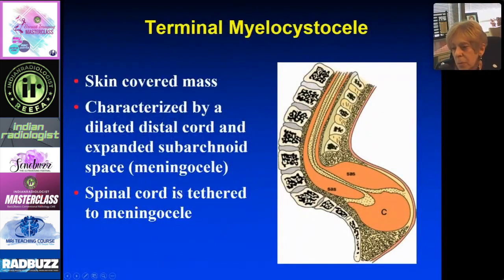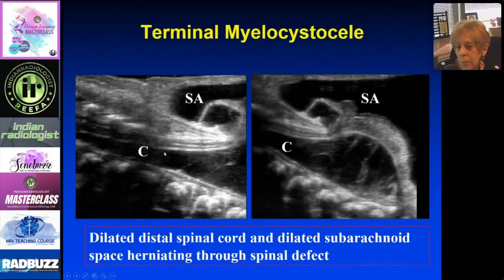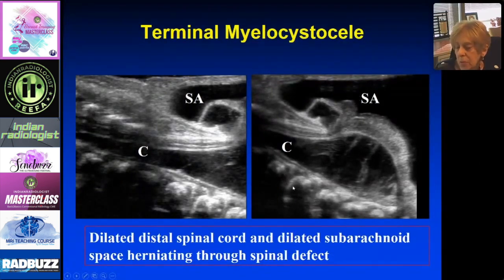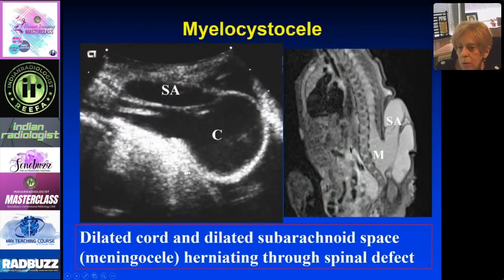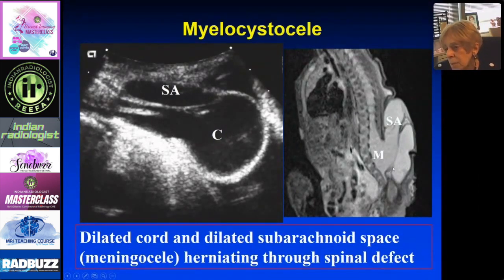The terminal myelocystocele is a complicated but skin-covered lesion characterized by a dilated cord that terminates as a huge cyst, surrounded by an expanded dilated subarachnoid space called a meningocele, with the spinal cord tethered. On ultrasound, you see a dilated cord extending way down to the sacrum with dilated subarachnoid space surrounding it. The myelocystocele is essentially a dilated cord, and you can see the cord being pulled down — tethered — with lots of surrounding subarachnoid fluid.